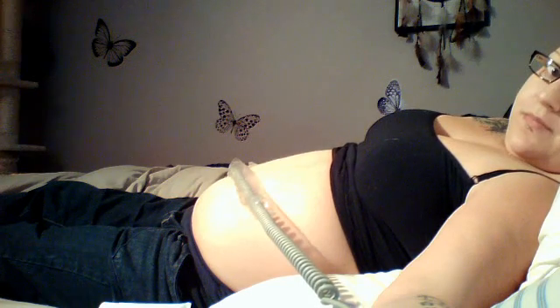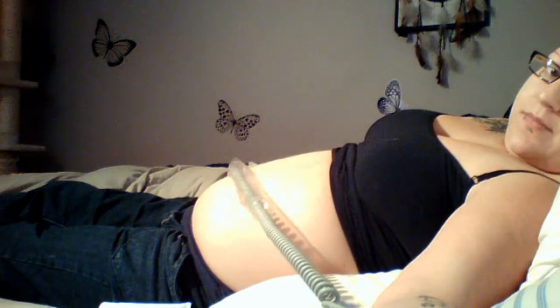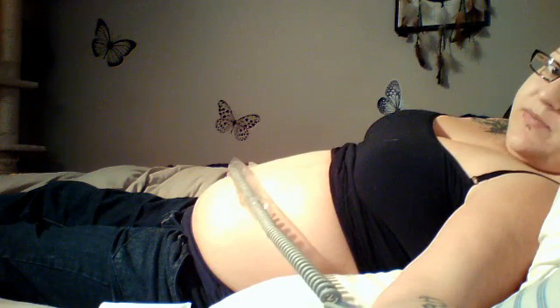Hi everybody. Weird position, I know. So I got my Doppler. I found the baby's heartbeat already, so you guys can hear it. This baby could get really active.